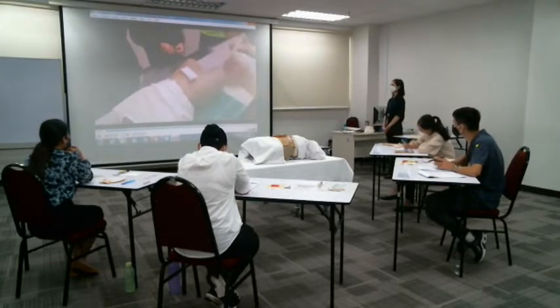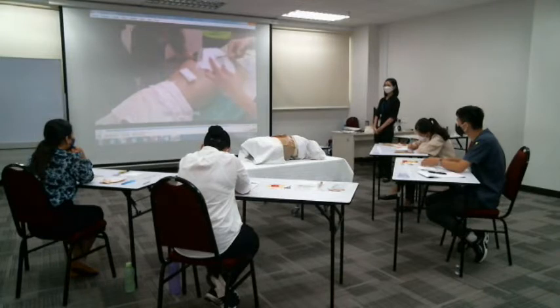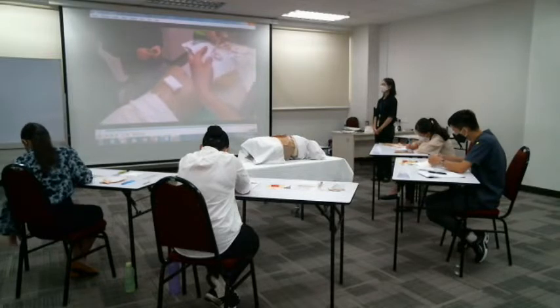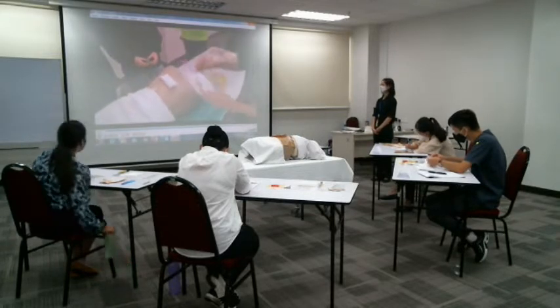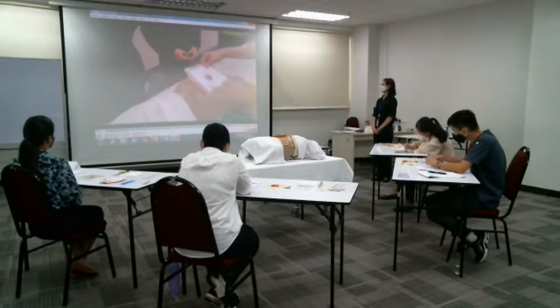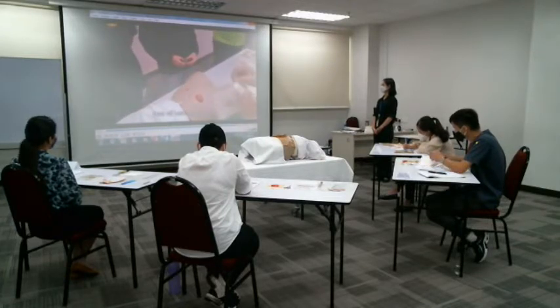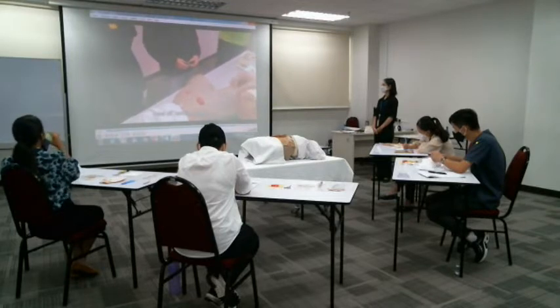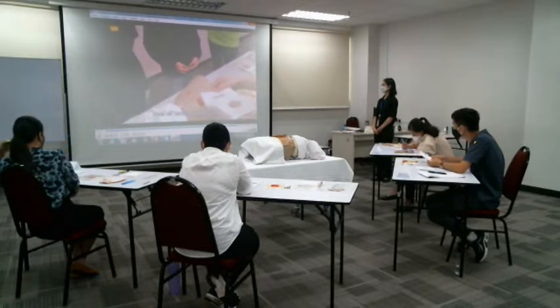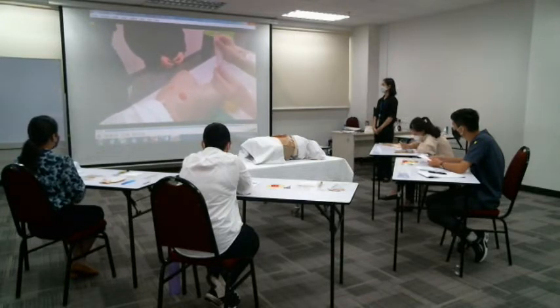I have to put in some air so that I don't accidentally cut here. I put it again on the colostomy bag. So with this now, and with the fix, my patient can walk, I will put it upright. In some bags you will have two parts. This one only has one part, so you got to be very careful with this one part.